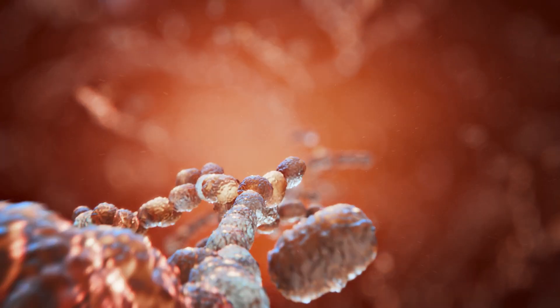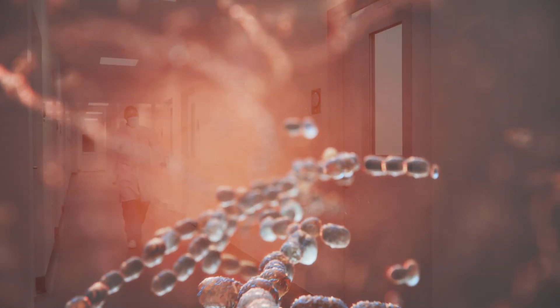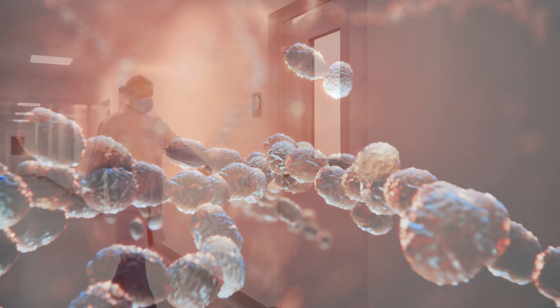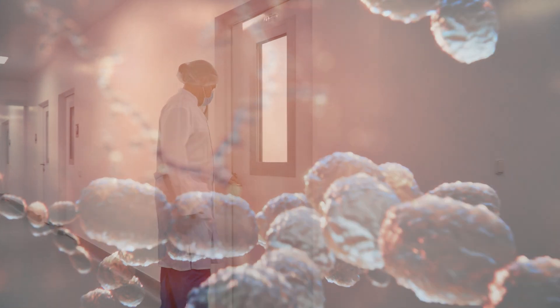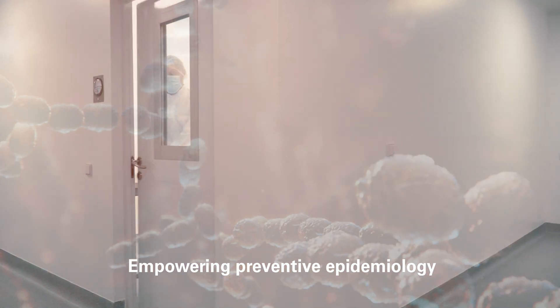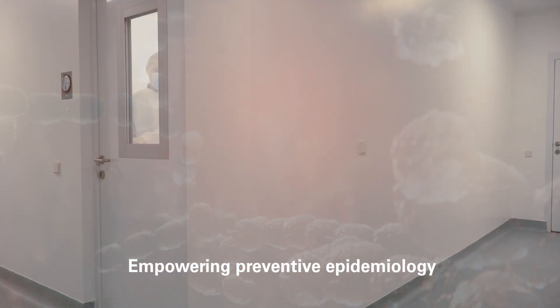The IR Biotyper delivers same-day strain typing results, allowing retrospective epidemiology to be replaced by preventive epidemiology.